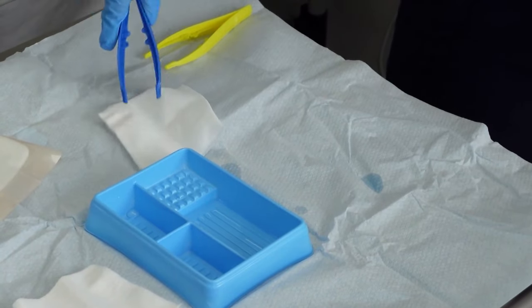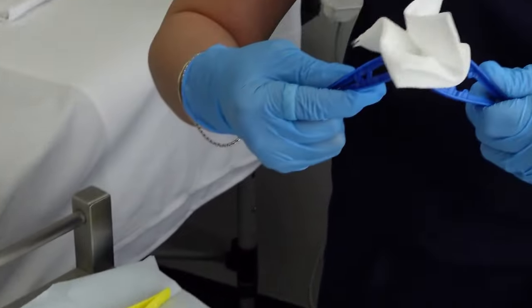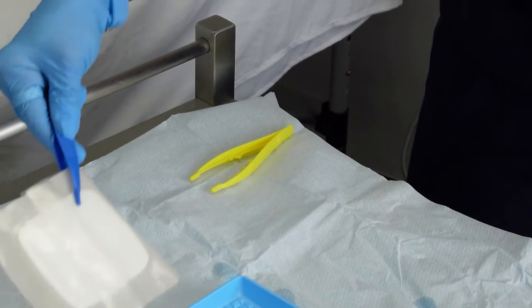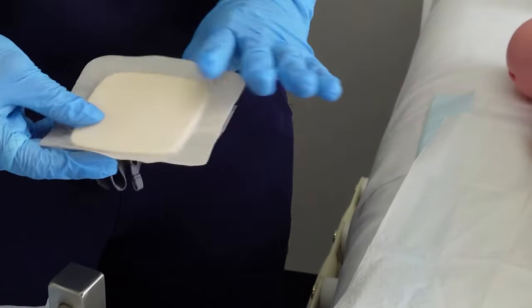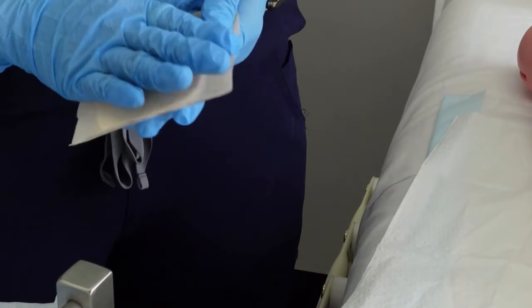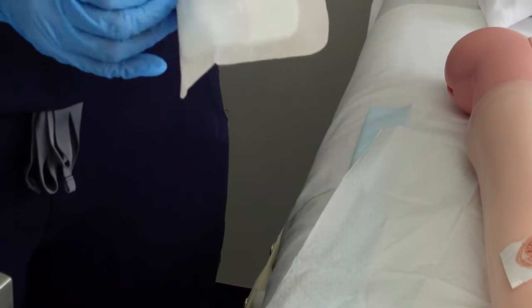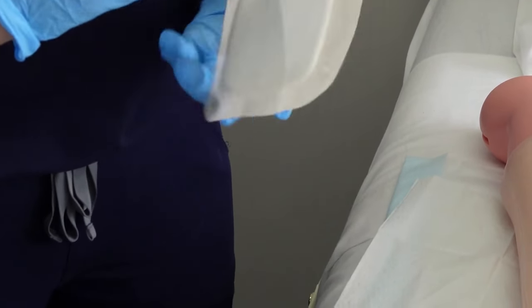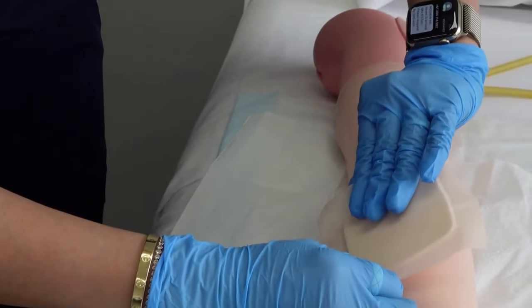Now it's time to dry the wound. Grab your wound dressing appropriate for the wound that you have. In case the wound is oozing a little bit, it's best to use a foam dressing, which can stay up to three to five days, making it appropriate for the current wound type. To dress the wound, remove the top film and preserve the sterility of the wound dressing itself, then place it on top of the wound.